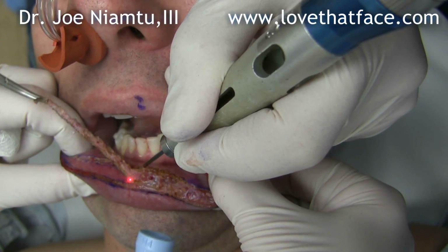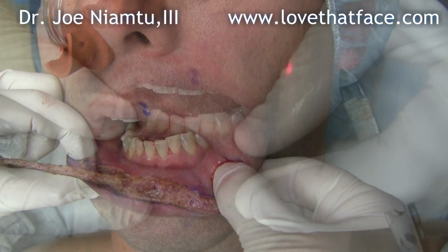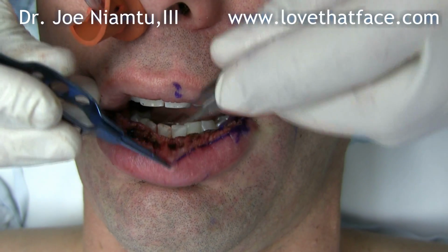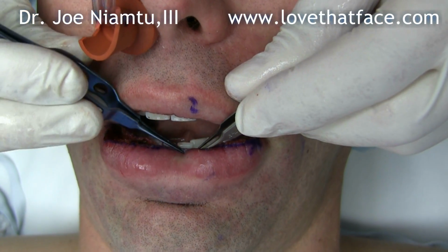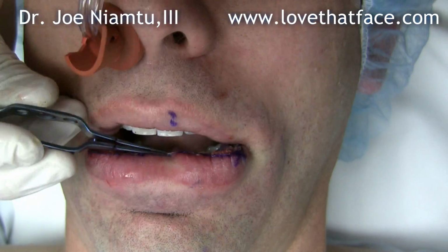So you can see how nice this comes off with the laser, and there's just zero bleeding, and we've trimmed some of the salivary glands, and the whole purpose of this is so this incision closes and the suture line will be on the inside of the lip. So at this point we're going to close this.